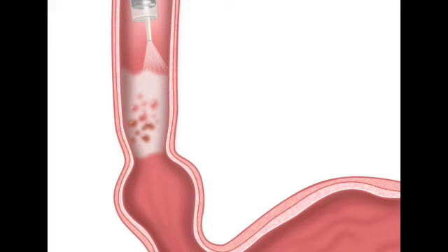Now we need to talk about what actually happens when this acid makes contact with the internal lining of someone's throat. This is where the magic happens. What is the camera seeing as they paint their way backward? Because earlier you mentioned that term, aceto-whitening. Right, aceto-whitening. This is the core concept from the source material. Okay. When the acetic acid makes contact with the Barrett's epithelium, which is the lining of the esophagus in these patients, a very specific chemical reaction occurs.